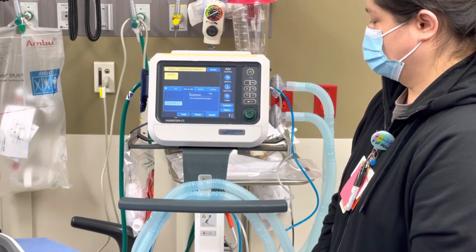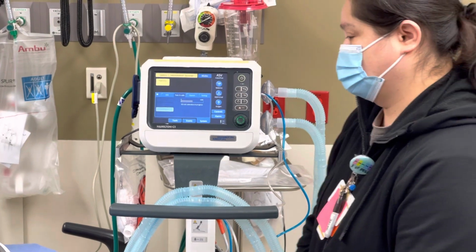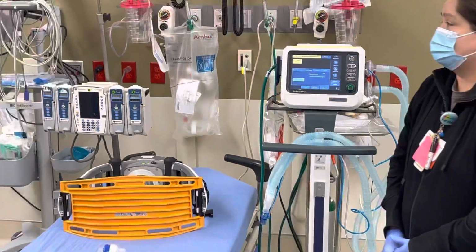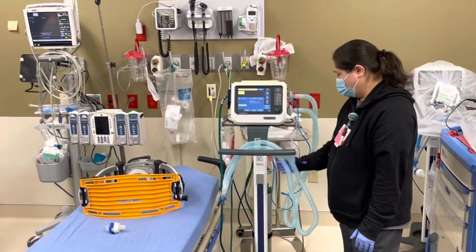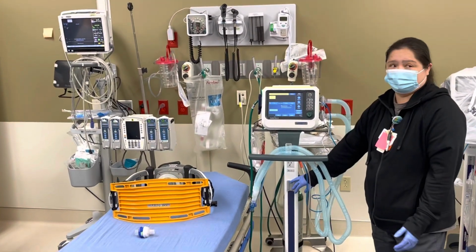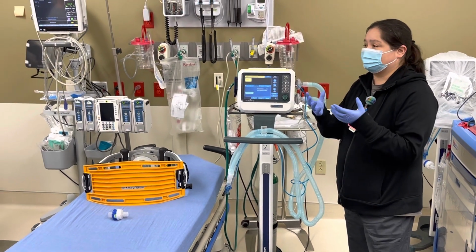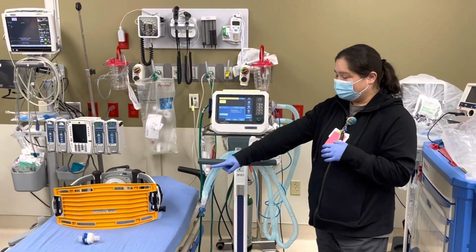So you took this thing off, it's the HME, yes. What is that? So that's gonna add humidification to the circuit. So basically, we don't have heaters, or we do, but this one does not have a heater that you put on. We don't normally just stick every patient directly onto a heater, but they still need some type of moisture. So that's what the HME allows.